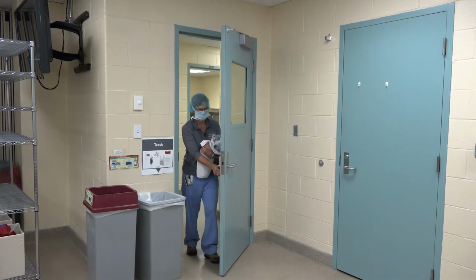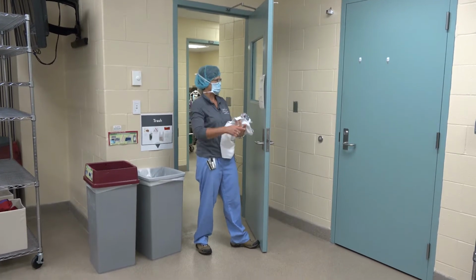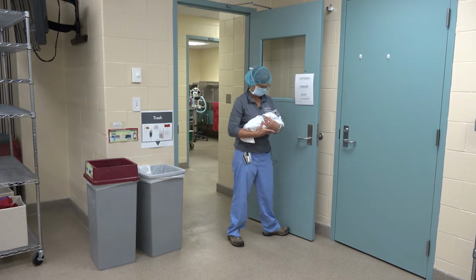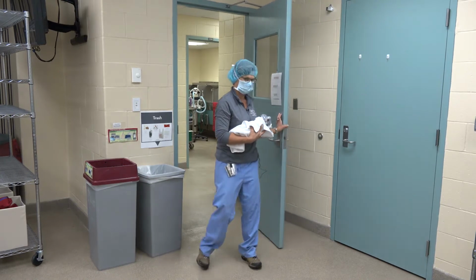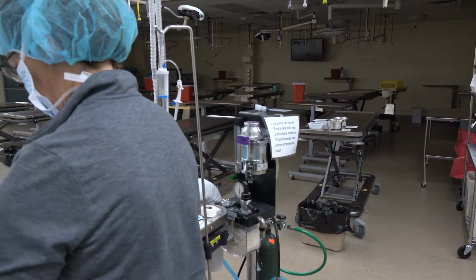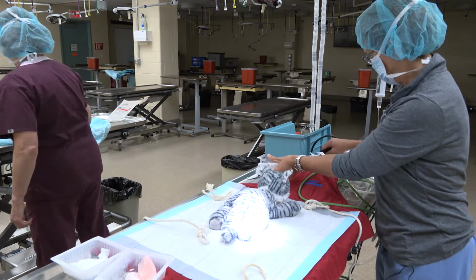All right, I have our cat, nicely pre-medded. You'll notice I have cap and mask on because I'm entering the surgery suite. It's required. I don't want to have people coming and going too often. I've got our kitten, and I've taken my lab coat off and put it in a locker. Now we'll go to our table, and I'm going to set up anesthesia. All right, and I'm going to hook our patient up to anesthesia.